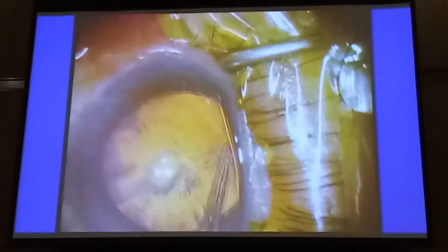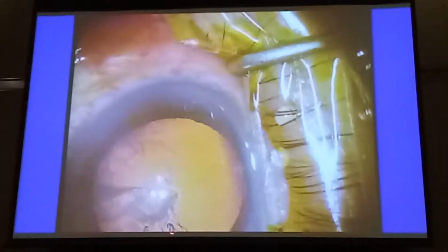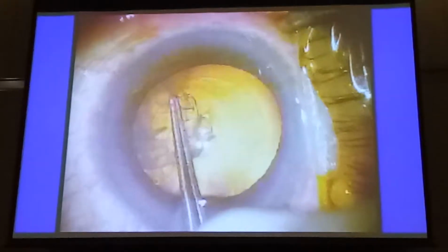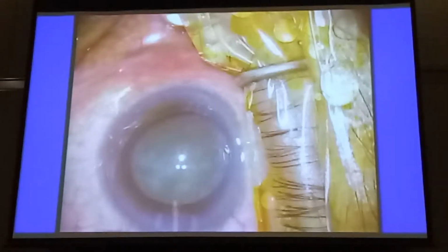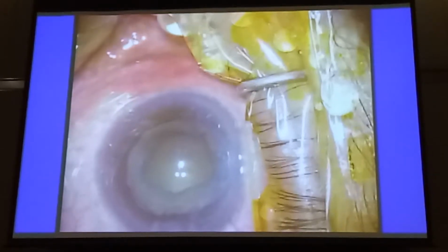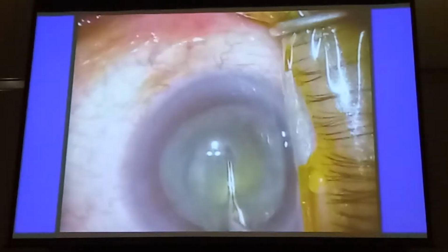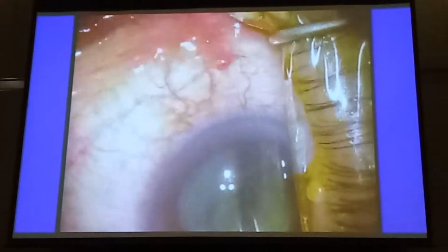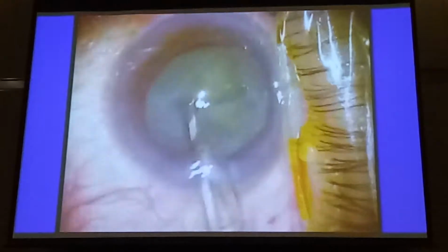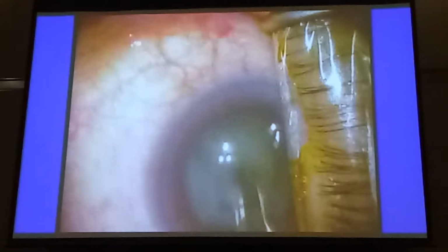Okay. Now here's another one. Now it's important to make a good size capsulorhexis, because when you're rotating or you're chopping the subincisional, you don't want to catch the edge of the rhexis, which you can do if you're not careful. But having done the good CCC, you want to do a good hydrodissection, and then the OVD is very important to push the cortex away so that the face of the nucleus is exposed. Here's the combo 2 again going in, pushing in. This was actually quite nice. You can see this is actually almost a 2+ nucleus, rotate 90 degrees and crack it, and it works very well.